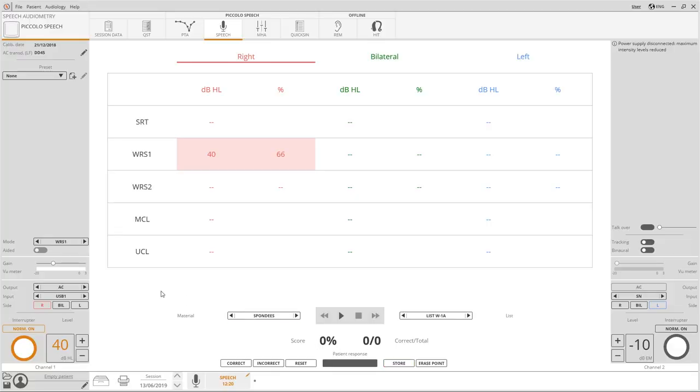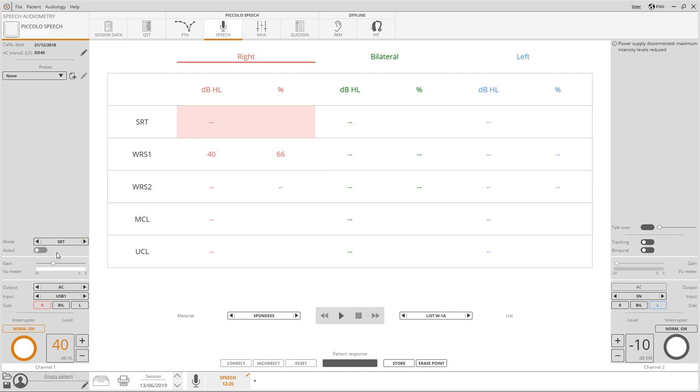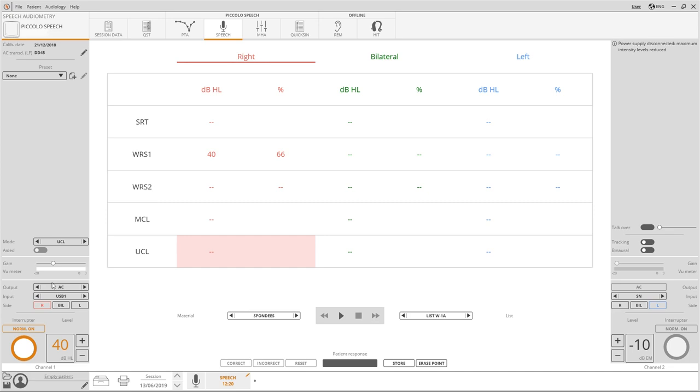With Piccolo it's possible to measure two curves on the standard WRS graph or alternatively with the SRT, MCL and UCL thresholds. Switch between the different test modes or select the desired option from the list.